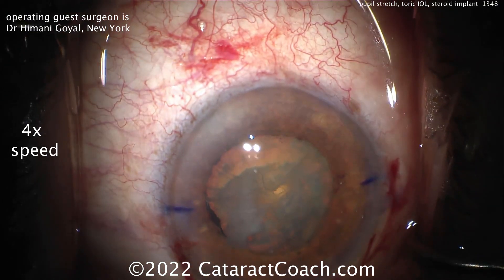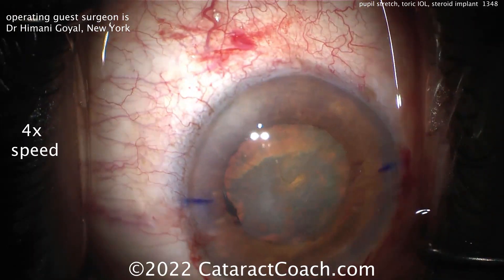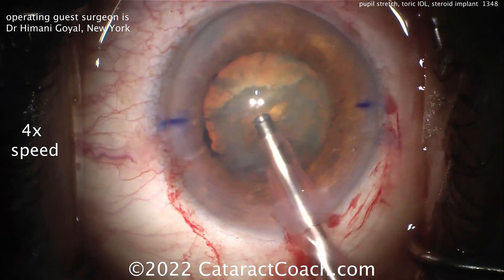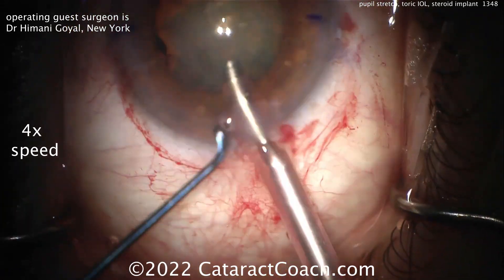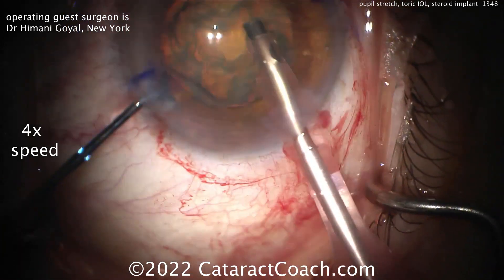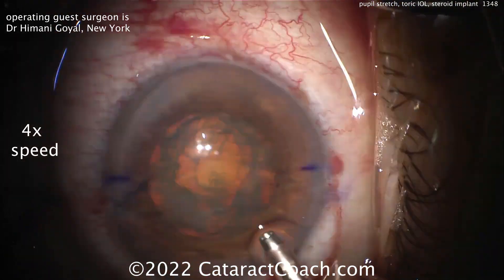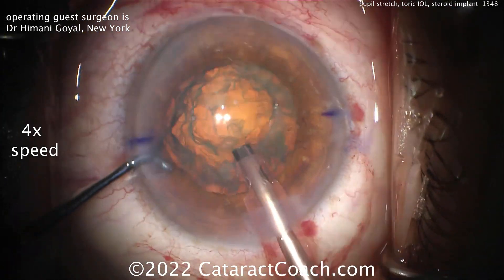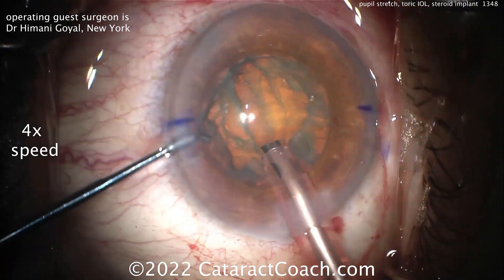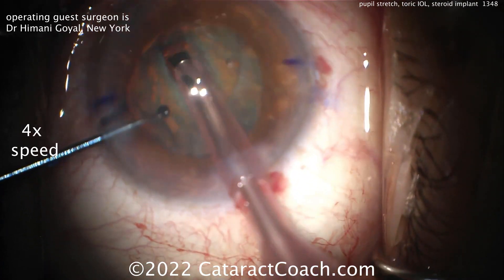I like that the incisions barely nick the limbal vessels. Now let's see the phaco technique — phaco probe going inside the eye and adjusting the sleeve there. Here's a chopper going in as well. Cleaning up the anterior cortex first to get a better view. Fixing that sleeve. Groove down the middle, looking good — only a few strokes are needed to get that groove going.